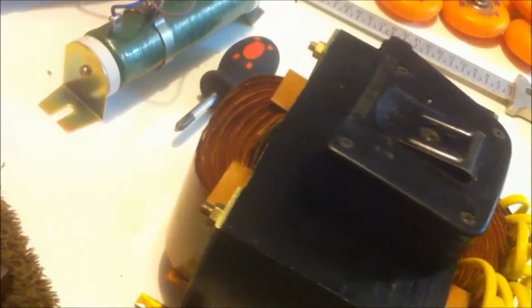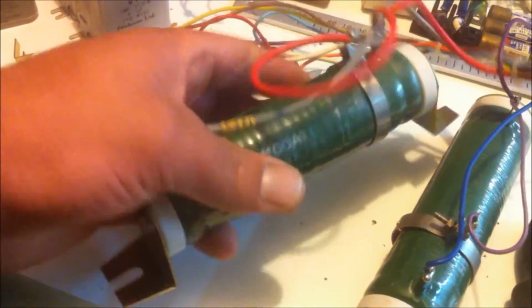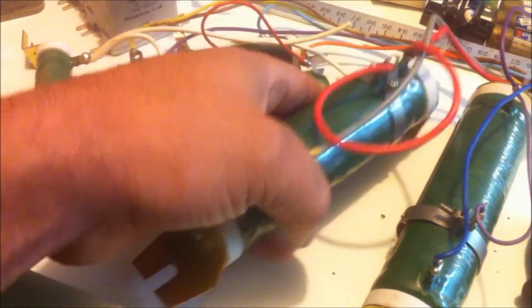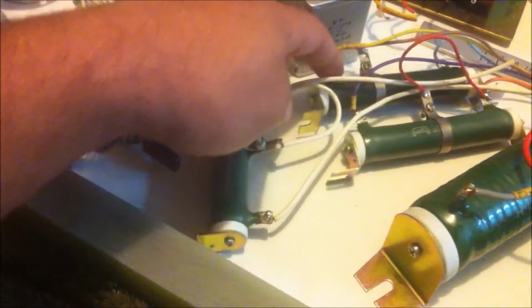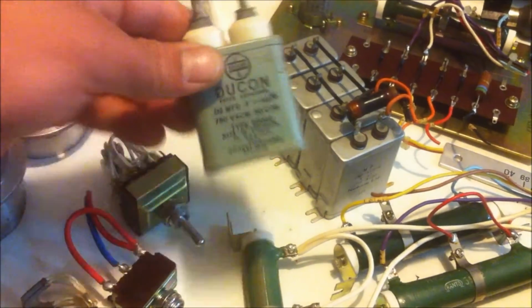This is another transformer that was in the actual X-ray machine. I kept all of the resistors. These ones are actually pretty chunky. I don't know how many amps you could put through that, but looks like pretty heavy wire. So I'm guessing it'll handle a bit of power. I've got two of those, one of these here. Also managed to get a couple of capacitors.